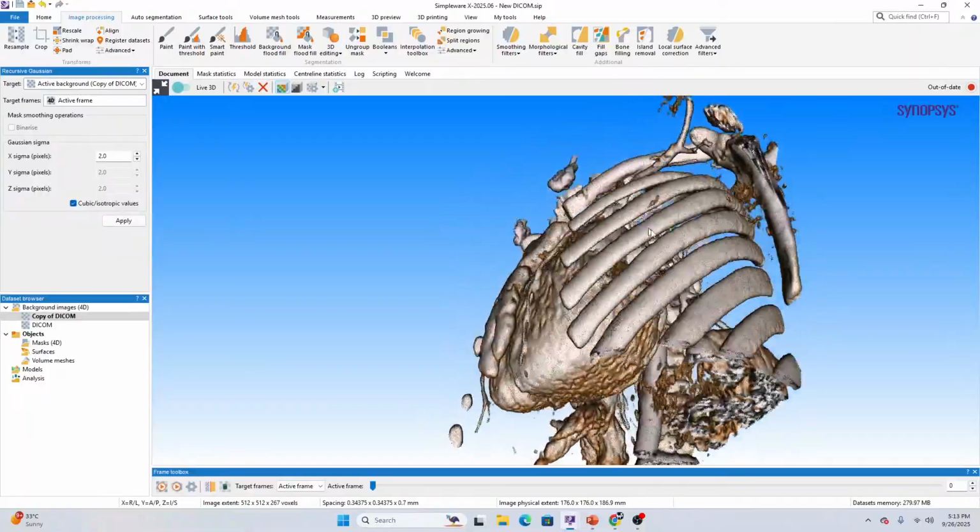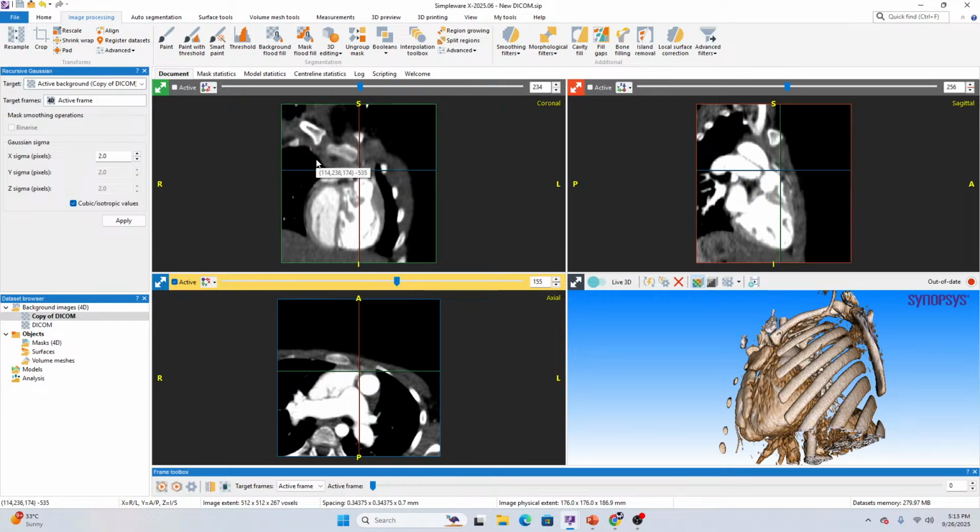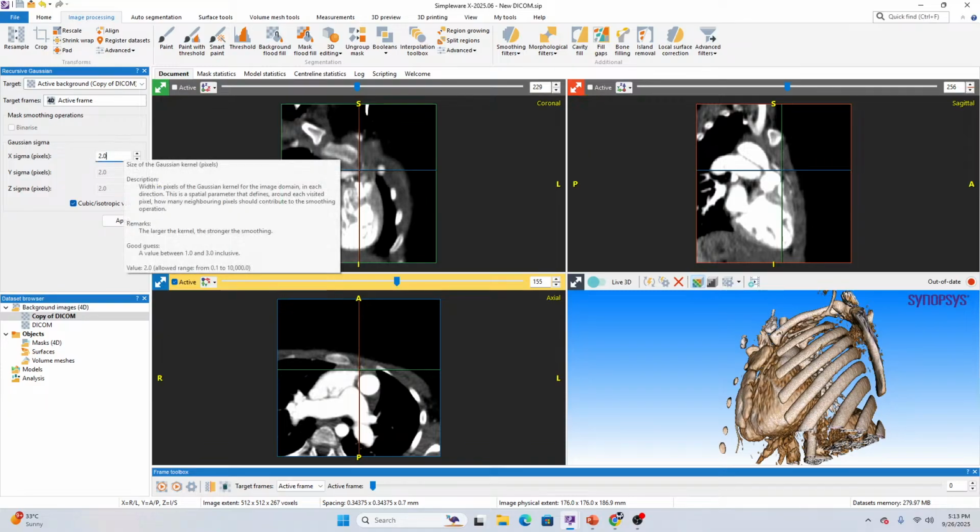There might be a question that it may also result in loss of features. That might be true. But a value of 1 to 3 pixels in recursive Gaussian is recommended for medical use cases. A value between 1 and 1.5 is generally fine while processing.